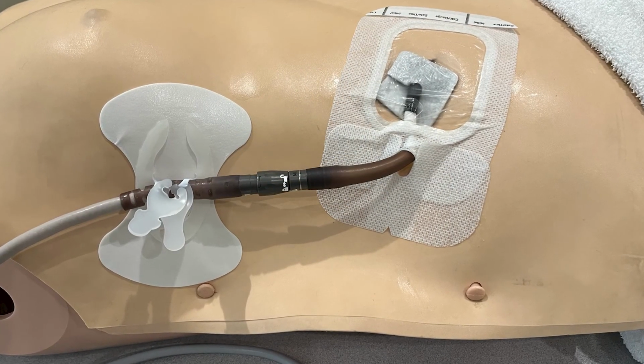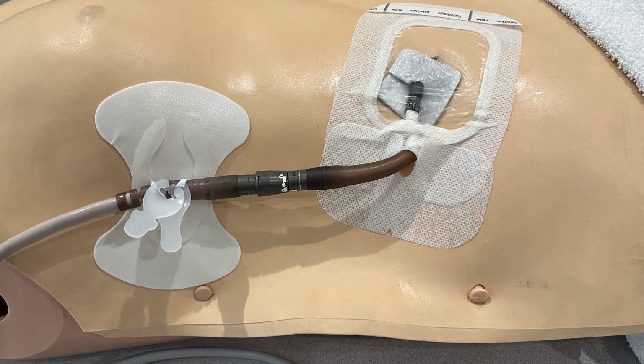So now we have completed our review of the drive line dressing change that you will be doing at home. Now the frequency of these changes depends on you and your family member. They are often daily until about 3 weeks after surgery and the site is healed, and then it can decrease to every other day or every 3 days.